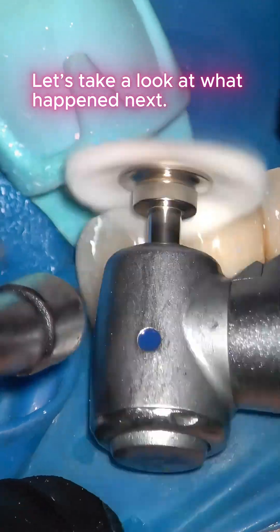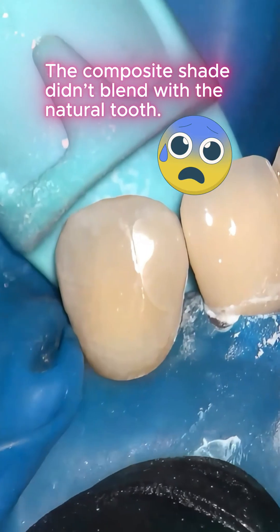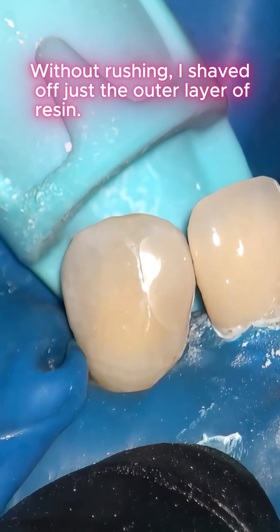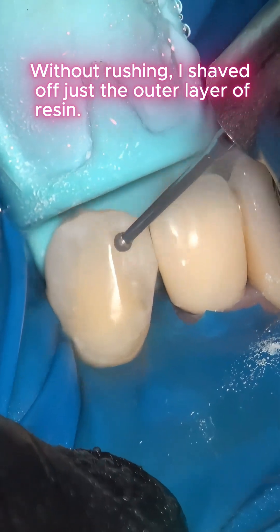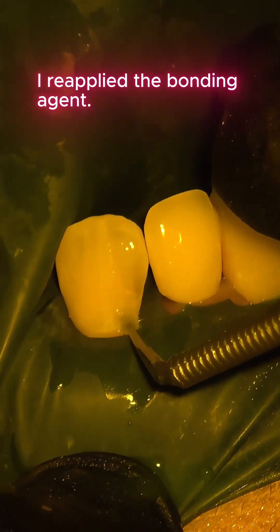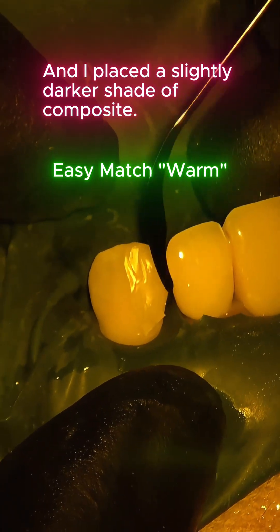Right afterward, the composite shade didn't blend with the natural tooth. Without rushing, I shaved off just the outer layer of resin, reapplied the bonding agent, and placed a slightly darker shade of composite.